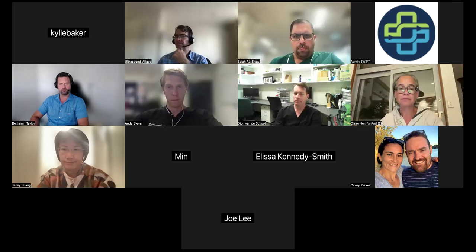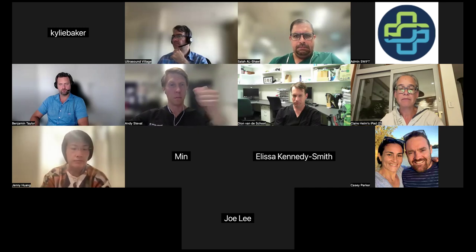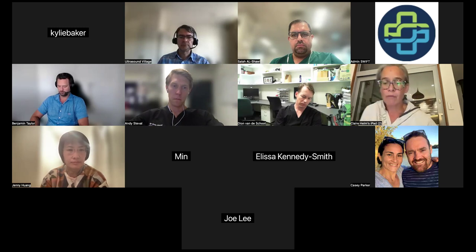So yeah, that's a little bit about the dynamic maneuvers and so on. That one. So this one I want to show you. This is what I'm going to do before, but I want to show you that one first. Okay. Let's have a look here.